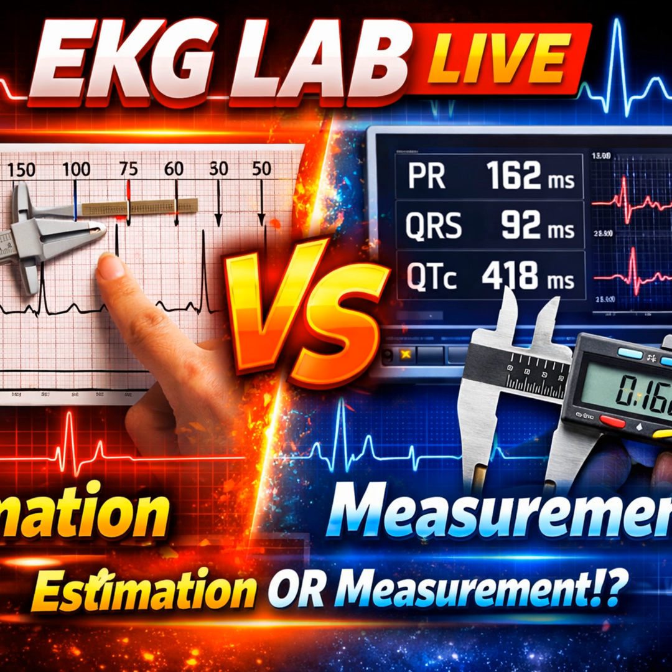Precise, objective. Sure, in a textbook scenario where the heart is beating like a Swiss metronome. But let's be real. That 300, 150, 100 method is cute. It works perfectly in a classroom or on a board exam. But code blues don't wait for you to find an R wave that lands perfectly on a heavy line. But the principle holds even if it doesn't land on the line, you just subdivide the boxes.